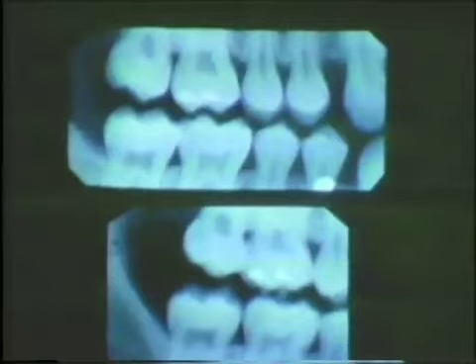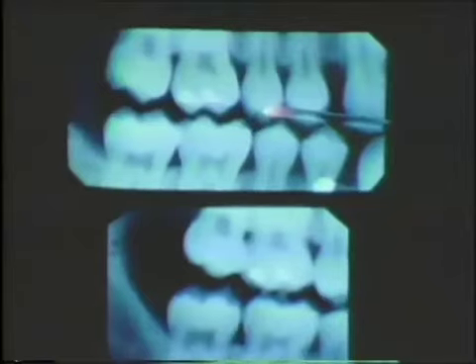In this case, the initial survey of the right side was suitable for all the maxillary contact areas. It likewise was suitable for the lower interproximals, with the exception of the cuspid first bicuspid contact. The supplementary film opened up that contact quite nicely. This interproximal survey film is properly done. The occlusal plane is horizontal on the film, and the upper second bicuspid tips are well aligned.